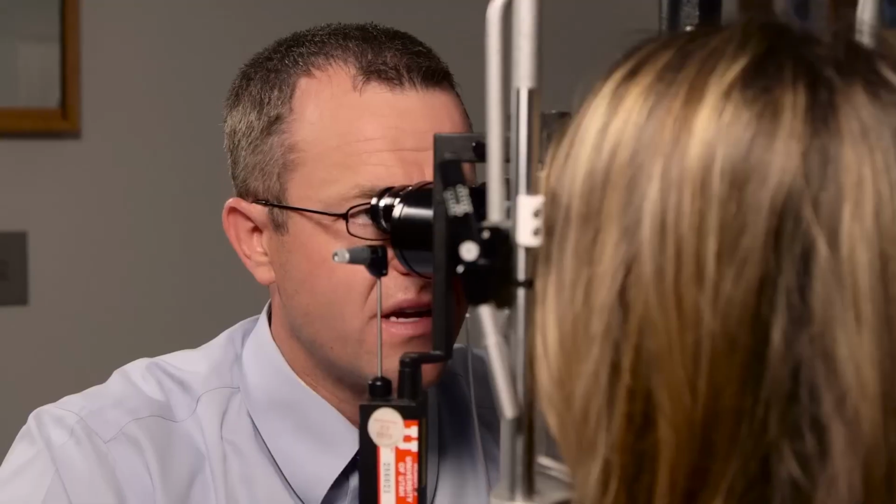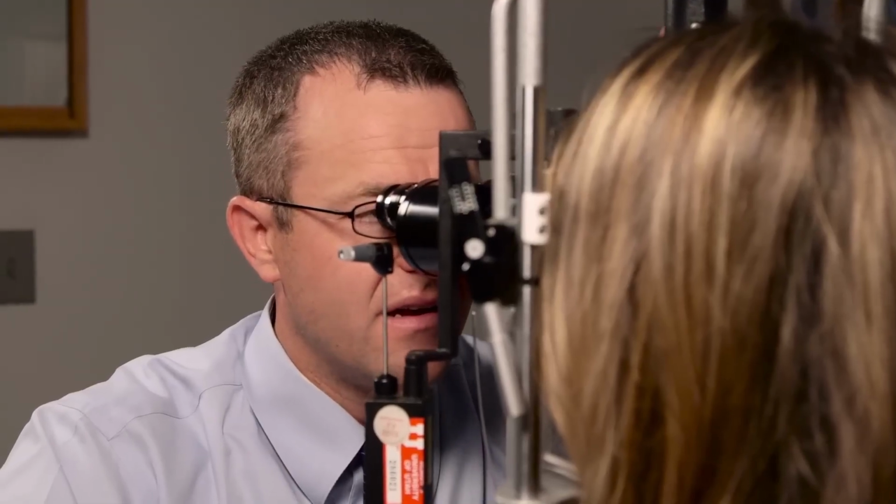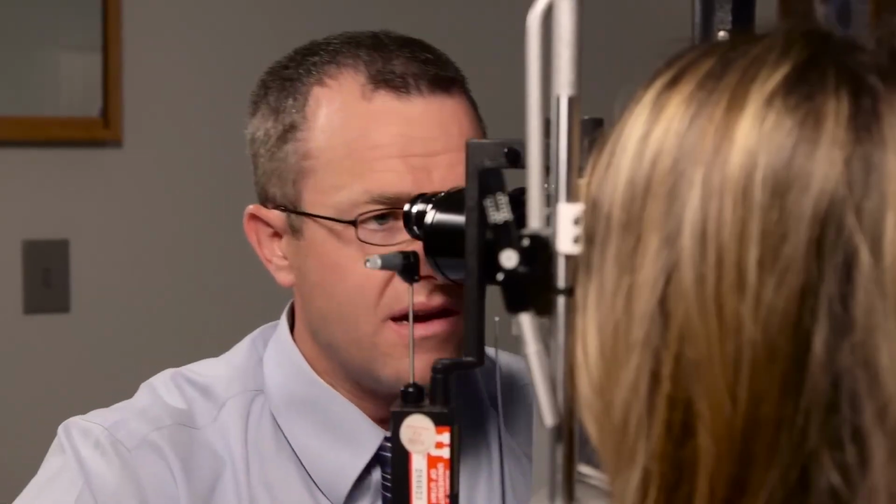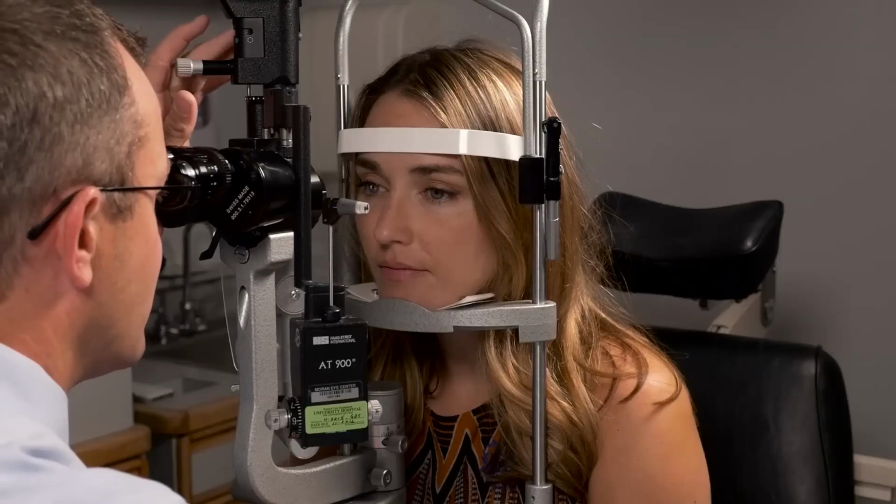After the cornea, you're going to look at the anterior chamber, and in the retina world, we do a lot of uveitis or inflammation inside of the eye exams. And so to look in the anterior chamber, you're going to narrow the beam, make it thin and narrow, and focus in on the iris.